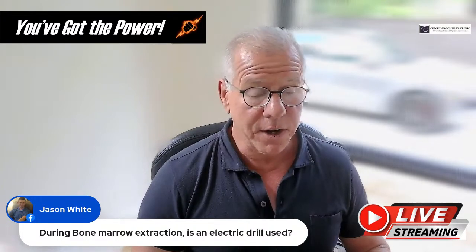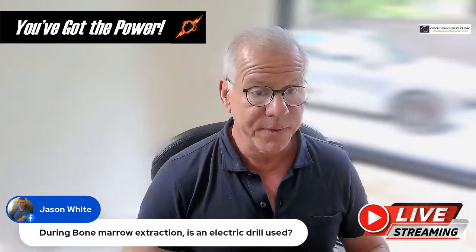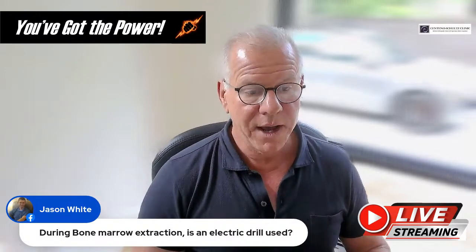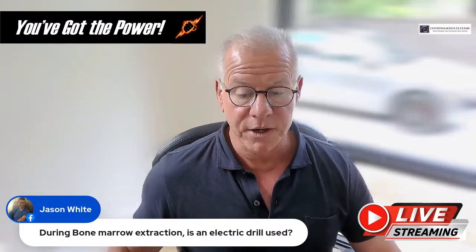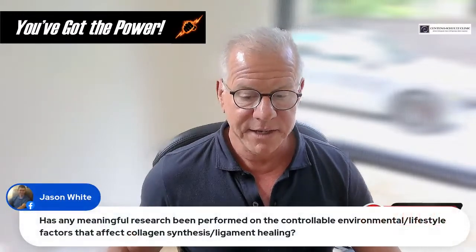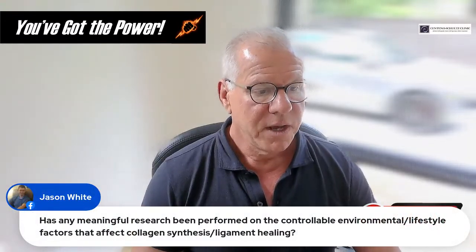I don't know of anyone strong enough to get through that tibia bone, which is about 10 times thicker than the pelvic bone. So in that case, you have to use an electric drill. Usually that's an on-control device. So that's the name of the company that makes it, Arrow On Control.